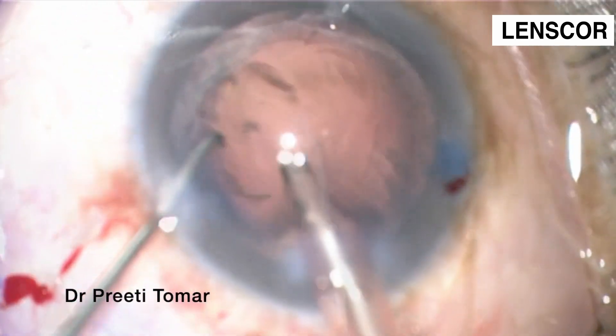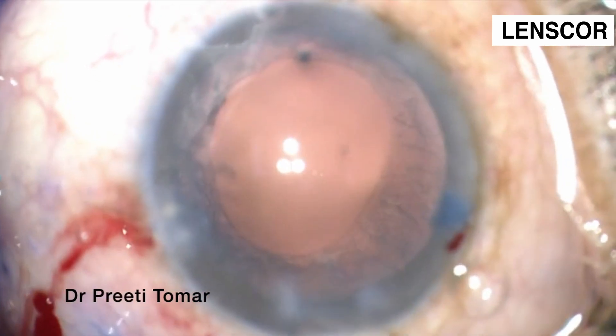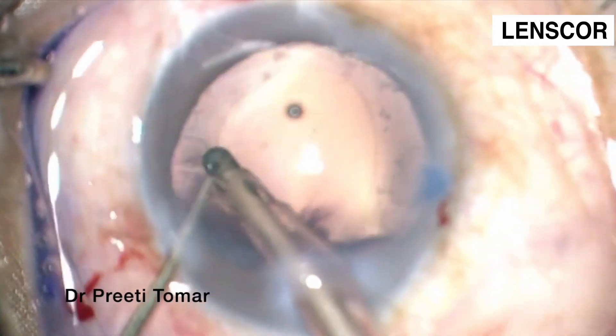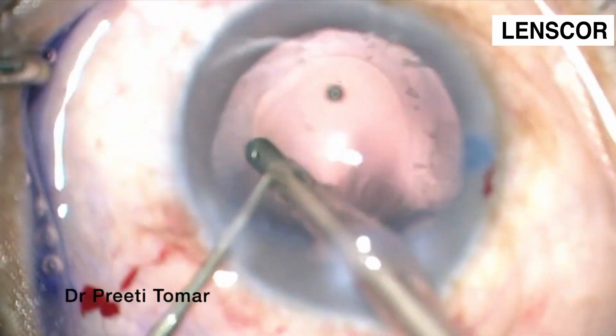We straight away proceed to irrigation and aspiration to remove the cortical matter. We found the cortical matter very sticky and try to remove as much as possible.